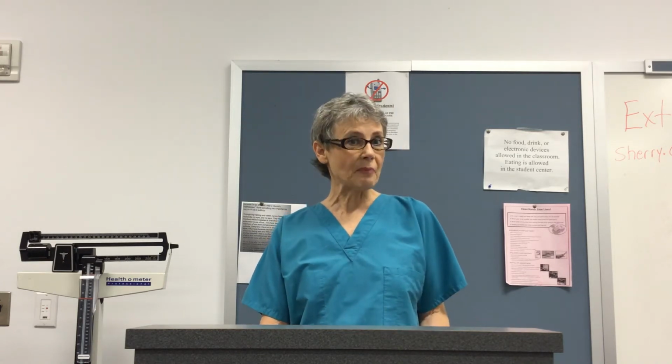Continuous means the IV fluids are infusing in the patient continuously, 24/7. Okay? Now, the nurse is responsible for monitoring this IV infusion every 2 hours. Every hour would be better, but in practical terms and from personal experience, I know that every 2 hours works out much better for nurses. If you were in the intensive care setting, then you would be monitoring much more frequently.